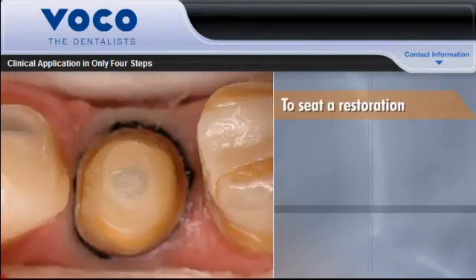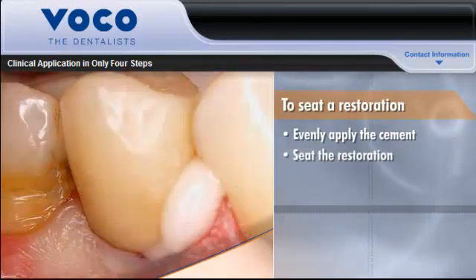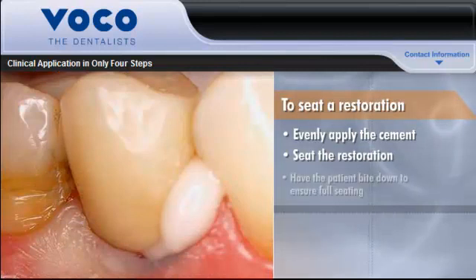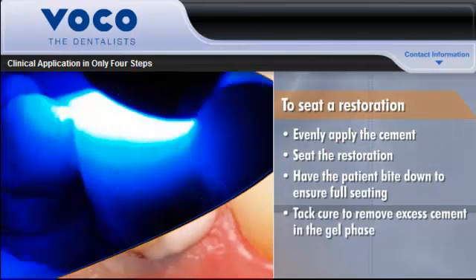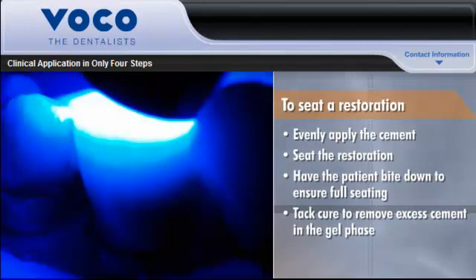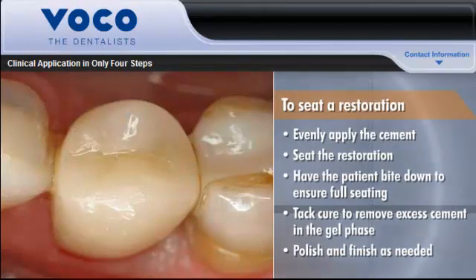To seat a restoration with Bifix SE, evenly apply the cement to the inside of the restoration and carefully seat it on the prepared tooth. Have the patient bite down to ensure full seating. Tack curing will make it easy to remove excess cement in the gel phase. Then polish and finish as needed. That's all there is to it.